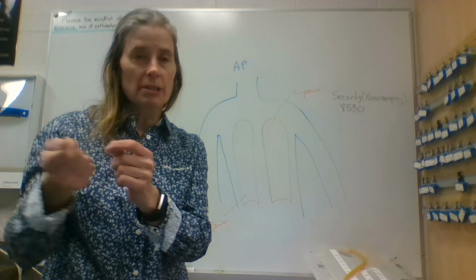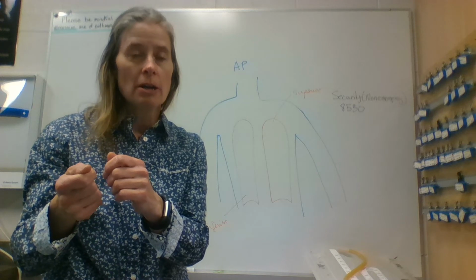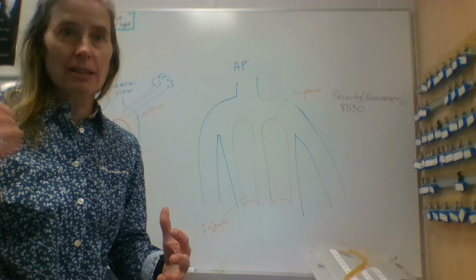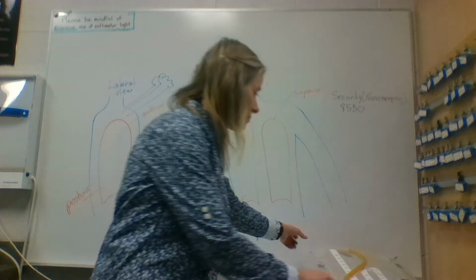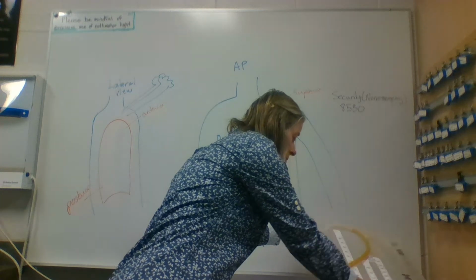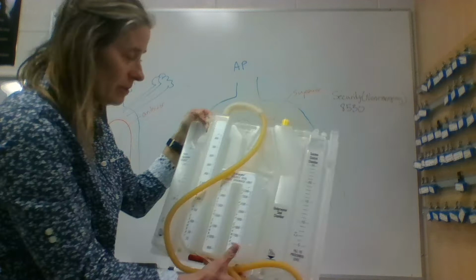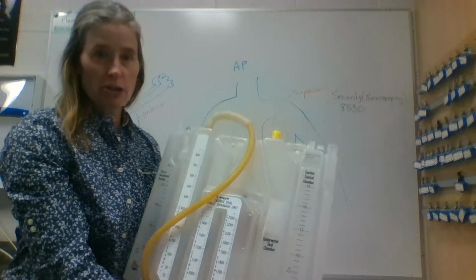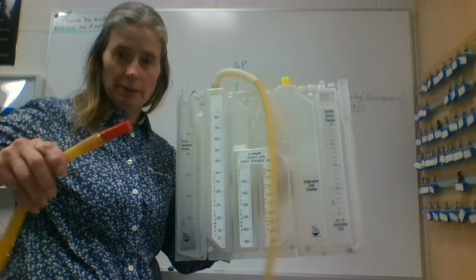So you'll see that kind of motion as they've entered the cavity, and right away they'll start to get the air. You'll start to get air, or you start to get blood up there. Once we have that chest tube inserted, it's going to be hooked up to a water sealed chest tube drainage unit.